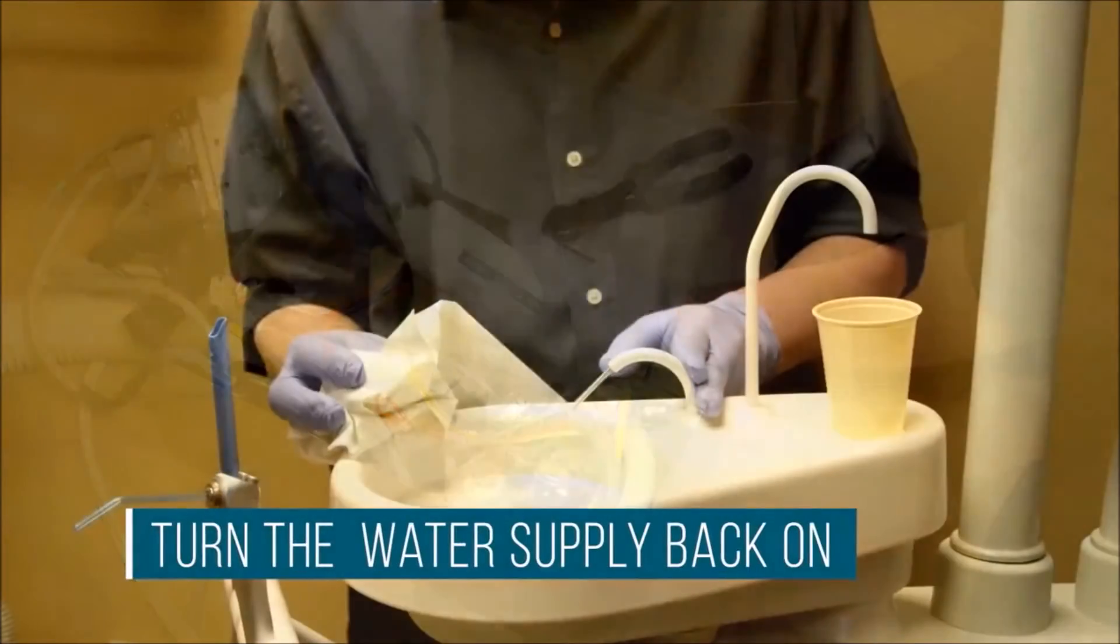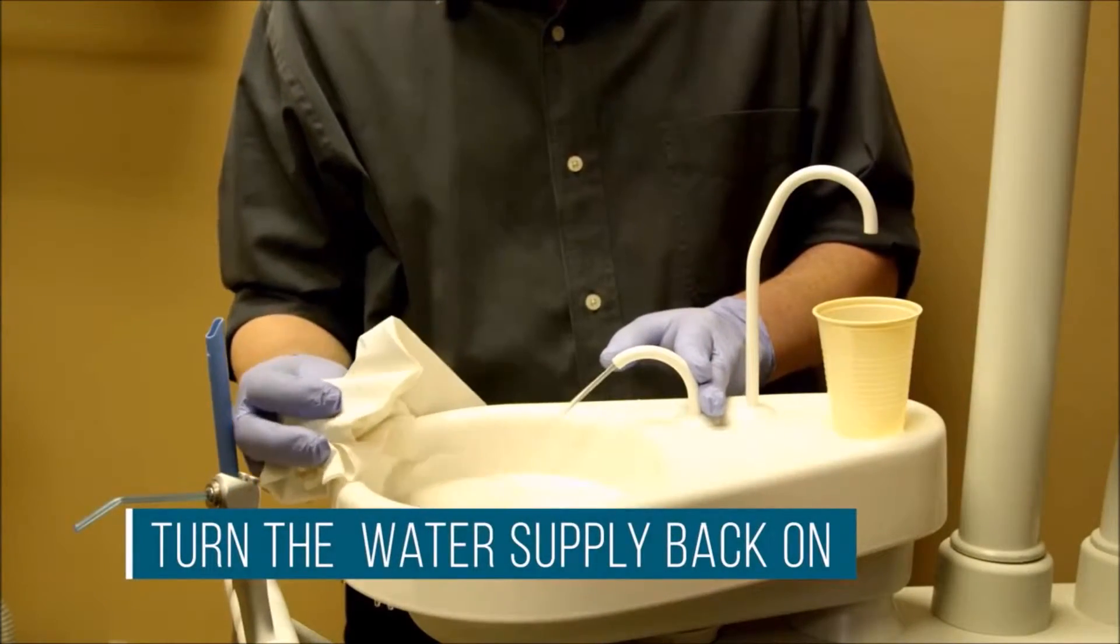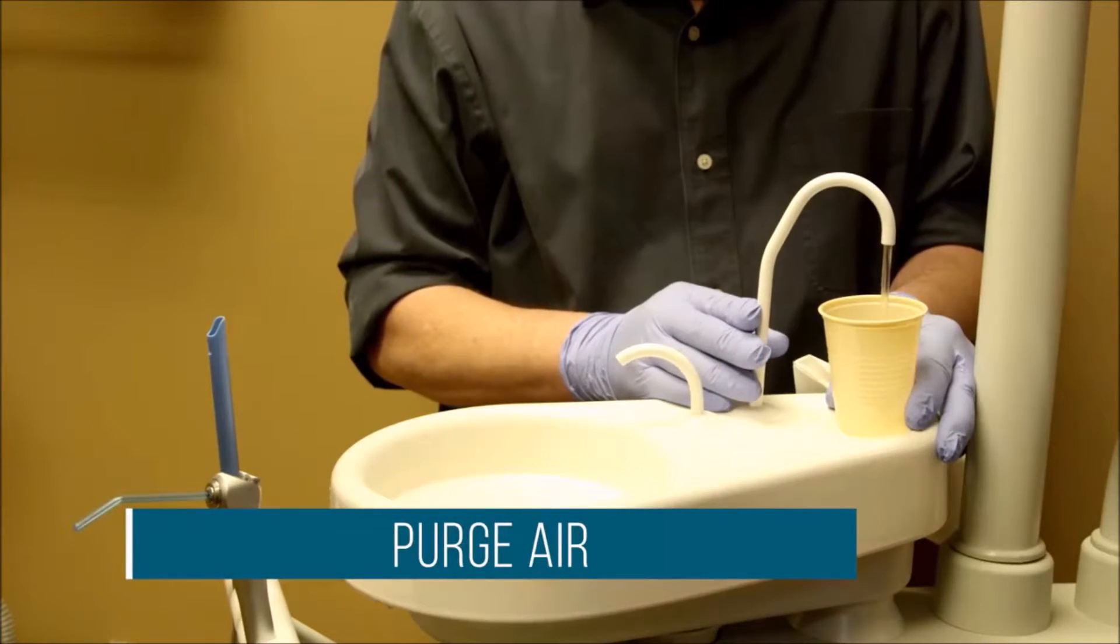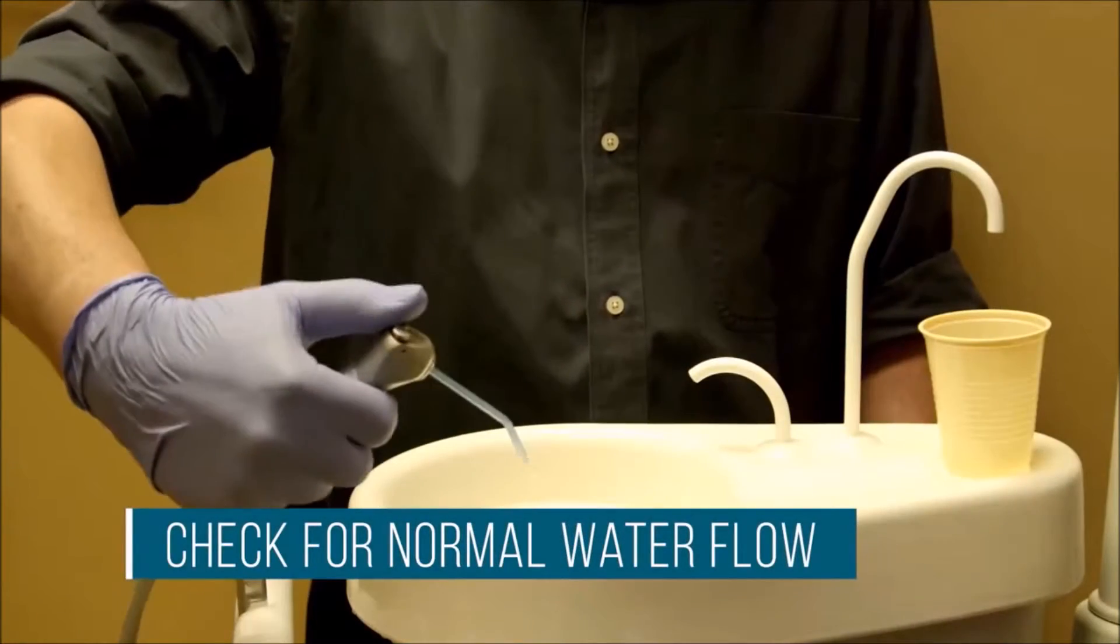Finally, turn the water supply back on and activate hand pieces to purge any air that might have entered the system. Check for normal water flow.